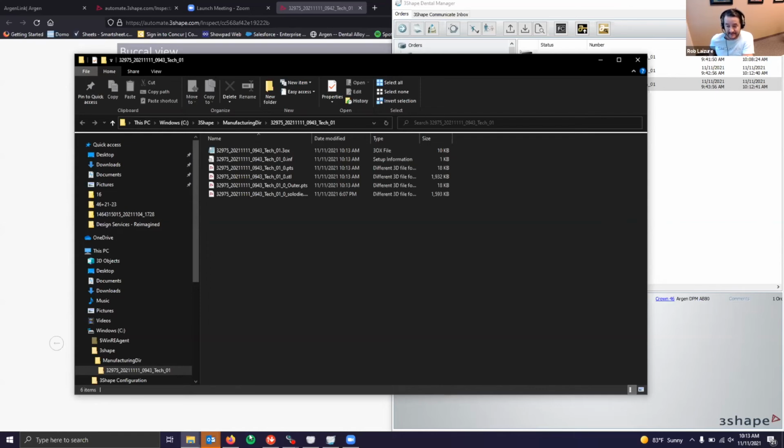Automate's very consistent. It's an algorithm, so it just follows rules. It just does what it's told all day, every day. It's available 24/7. Automate will design cases on Sunday morning. We won't be designing cases on Sunday morning. We're reading the newspaper and eating our bowl of cereal. But Automate will be there to design for you on Sunday mornings if you really need it to.